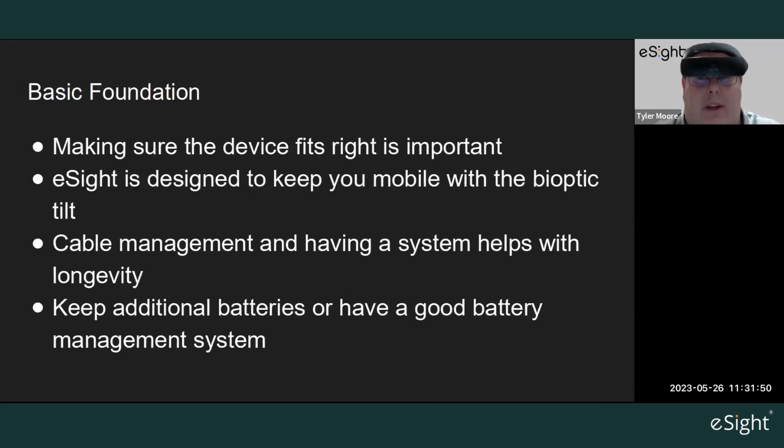The basic foundation of using eSight: we always want to make sure the fit is important — making sure it's comfortable, that the handle is snug on your eSight board, especially when moving around the garden. You want everything feeling secure on your head. eSight is designed to keep you mobile with the bioptic tilt, so utilize that tilt when moving around or doing different activities, then use the zoom and tilt to look underneath while staying mobile.